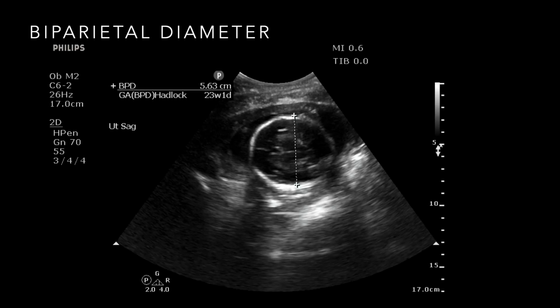As we approach our third trimester, thinking about 5 centimeters is a reasonable number. As you scan these, keep in mind what the numbers are, so you can get a rough idea when you glance at the patient.